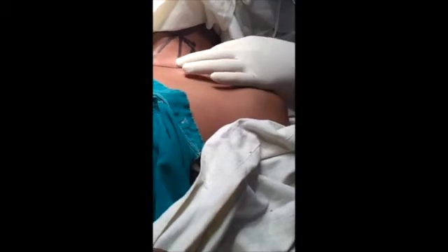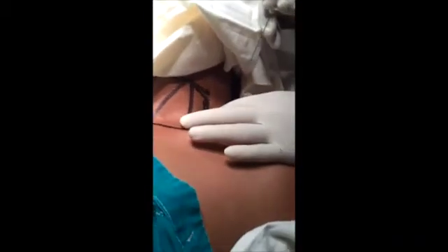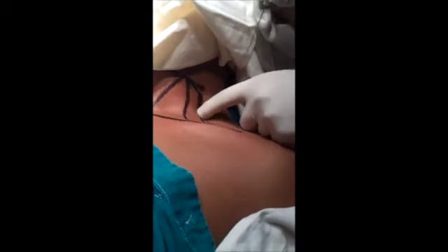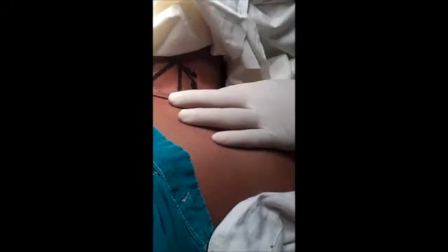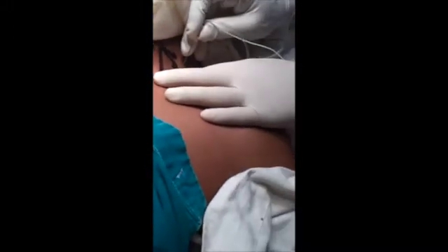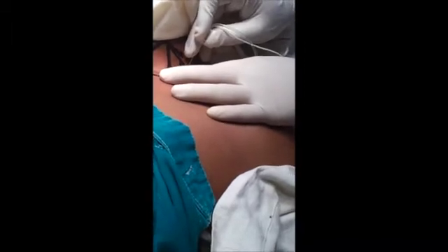We will go here — that is the 50mm needle. I'm asking the patient to sniff. This is the interscalene group. My finger is over the interscalene group and then we will go in the groove.